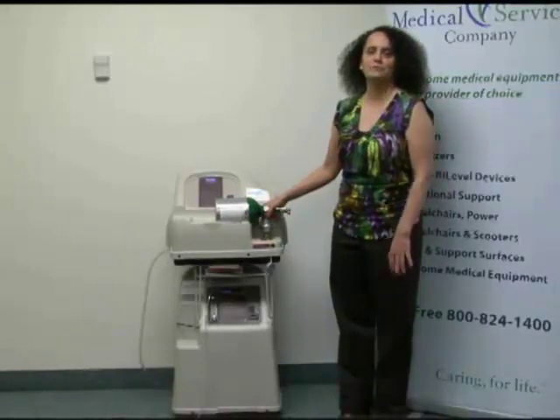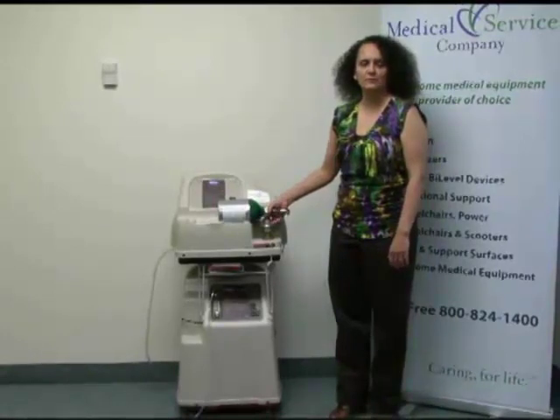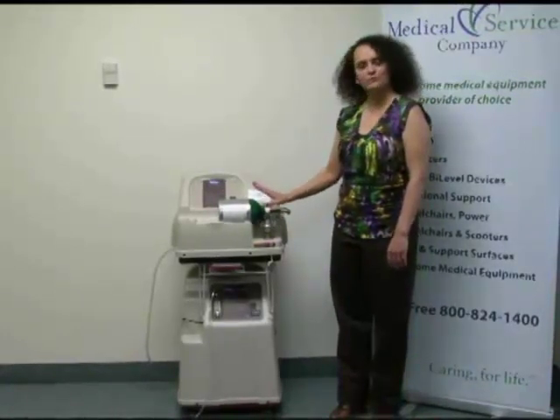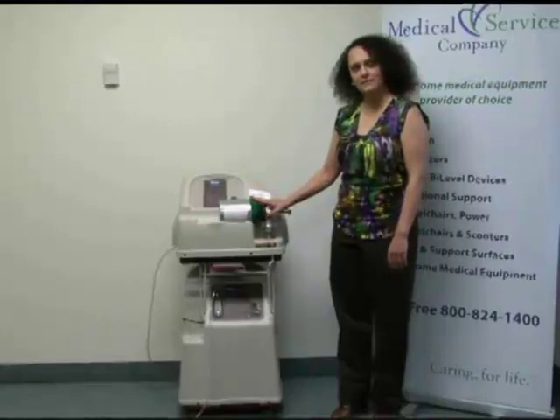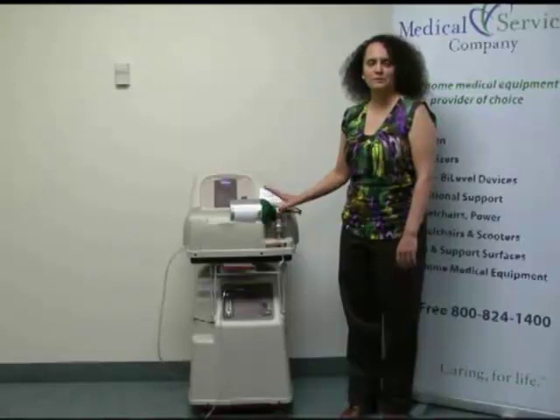You don't have to have someone come and exchange them. You don't have to ever worry about running out of oxygen. You always have a way to refill your own tanks. This can be used by anyone who's on three liters or less. If you're over three liters, you definitely want to consult your respiratory therapist if this is something you would like to use.